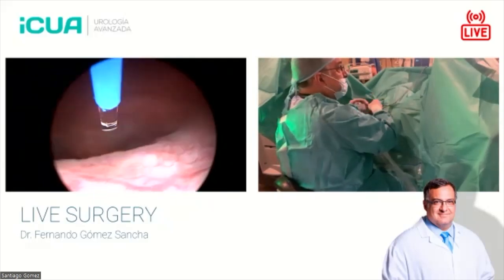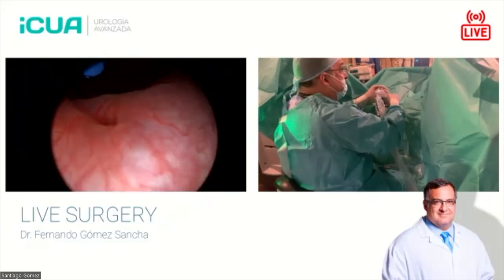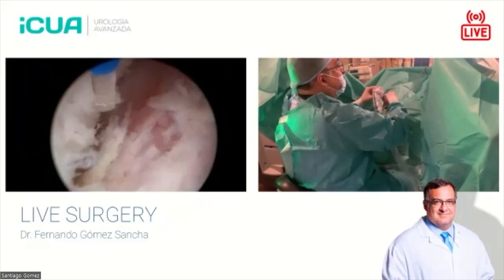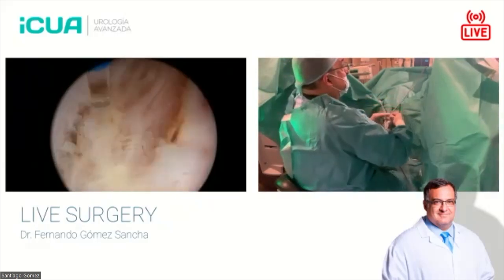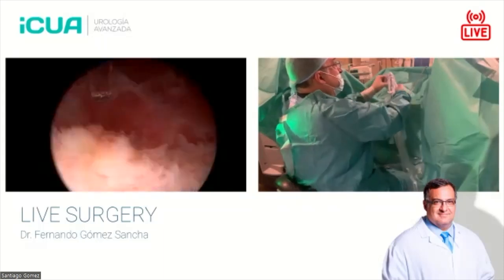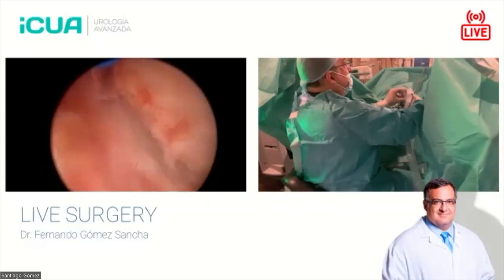You see that looks like the bar. This is the UO. So we're not so far. And we have to be careful with that. But you see, now I can go from the lateral aspect all the way to enter the bladder neck here. So let's go to the other side and we will try to do the same.